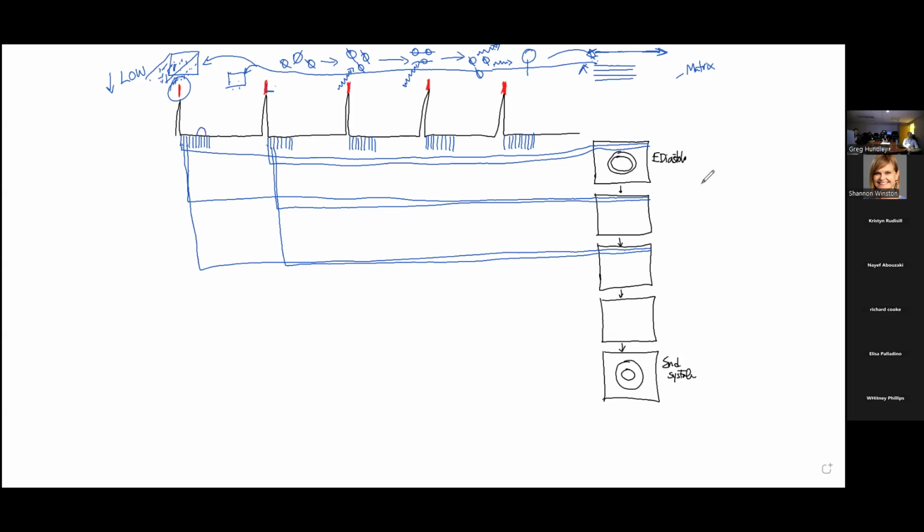We're getting into end systole, right? And so we can capture the time frame down here. So you got a nice, clever way. It's kind of beautiful in some ways because you have implicit averaging, right? You're averaging this movie frame over a series of heartbeats, right? Everybody got that? And that's how we make the movies.